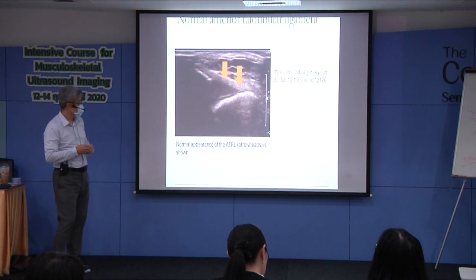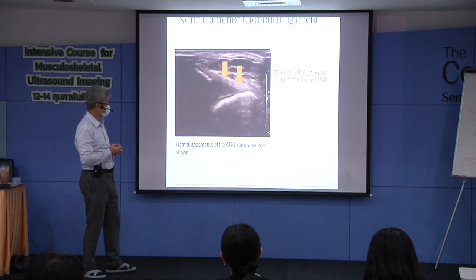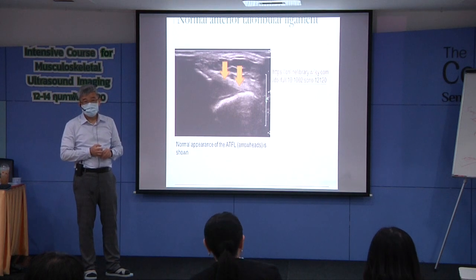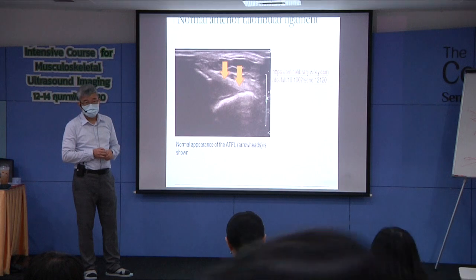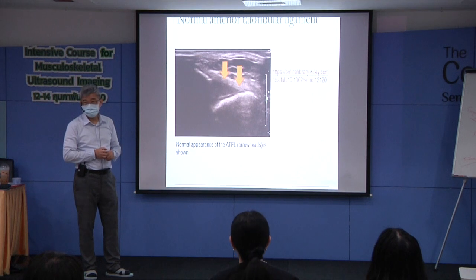Okay, healthy ATFL. I think this is no problem at all for you now. Honestly, it is not possible to become familiar with ultrasound in 3 days. Not possible. But you can become very interested in ultrasound imaging in 3 days.